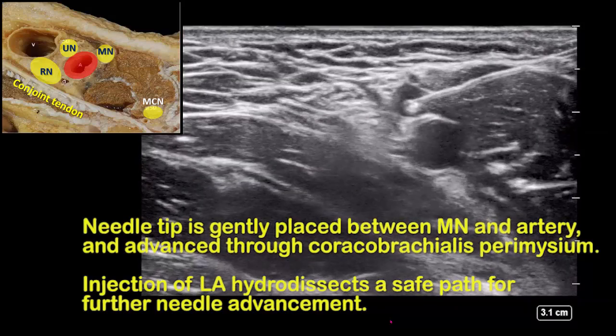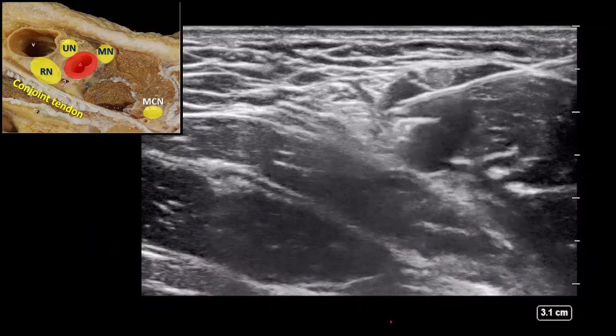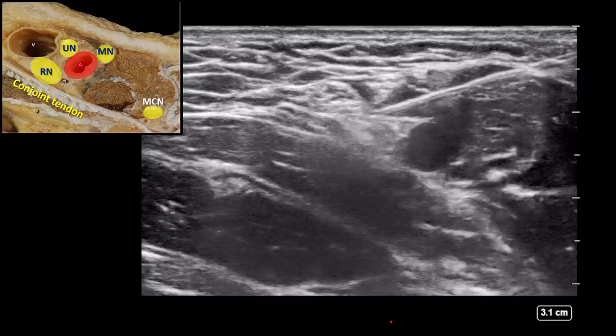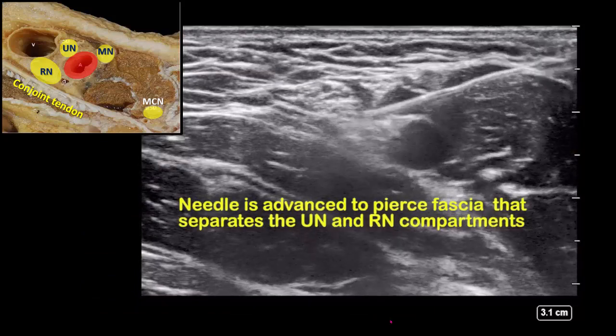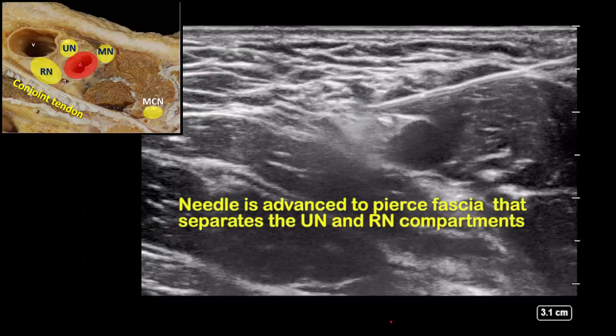Advance along this hydrodissection path into the vicinity of the ulnar nerve. Then depress the needle tip to pass over the artery and the radial nerve and to pierce the fascial roof of the radial nerve compartment.